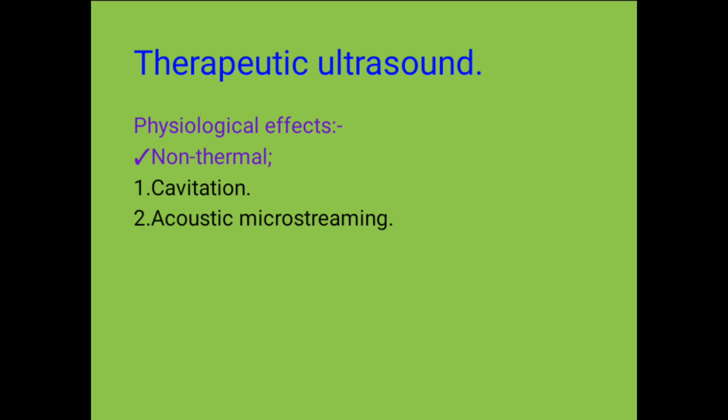Maybe to mention how we use therapeutic ultrasound: your patient needs to be in a comfortable, safe, quiet and well lit place. If it requires undressing, they should undress only the part to be treated. You first apply a coupling media, then ensure that your device is on.